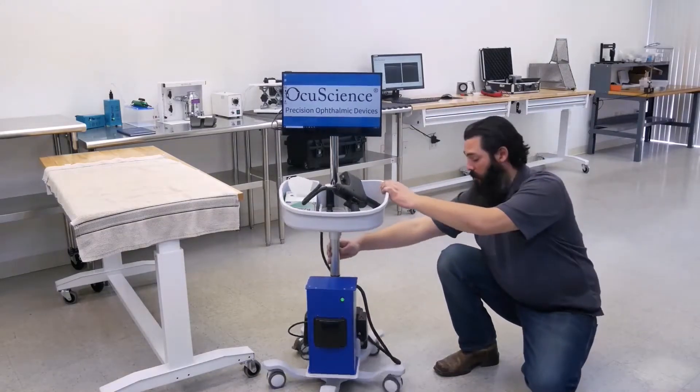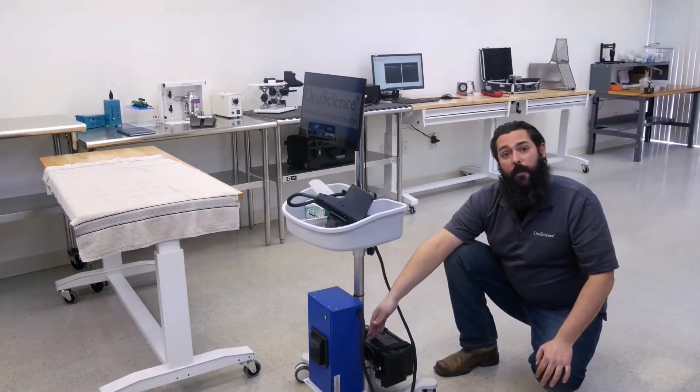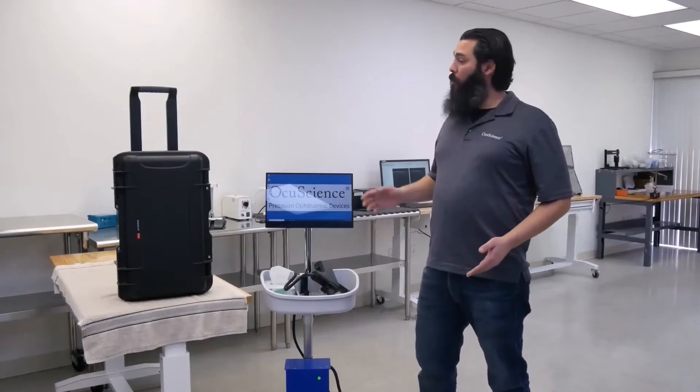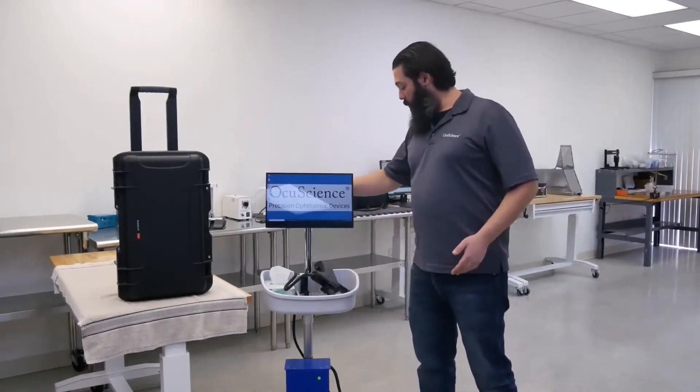Our mobile cart option comes with its own battery pack that gives it up to 45 minutes of runtime out in the field. With our OCT being so small, we're able to put it in a Pelican-style roller case for travel or even mount it to a mobile cart.